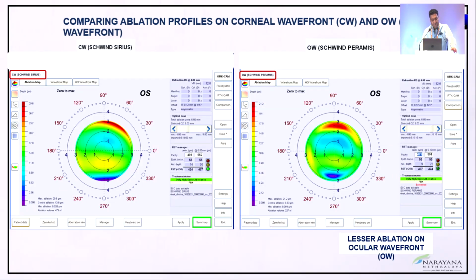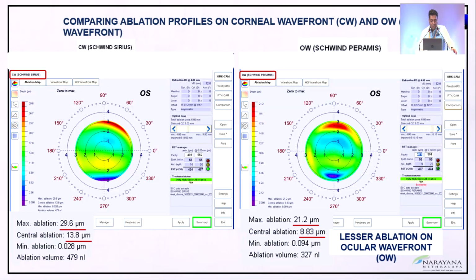But the challenge here is, when do we choose, and what do we choose? Many times when you have only corneal-related aberrations, the amount of ablation is huge because it assumes that everything is the cornea, as if there were only one lens in the eye. But when you have a cornea with a total aberration, it neutralizes a lot of aberrations from the lens. The lens neutralizes aberration, so the amount of ablation on the cornea gets minimized. It compensates for what is naturally happening in the eye.